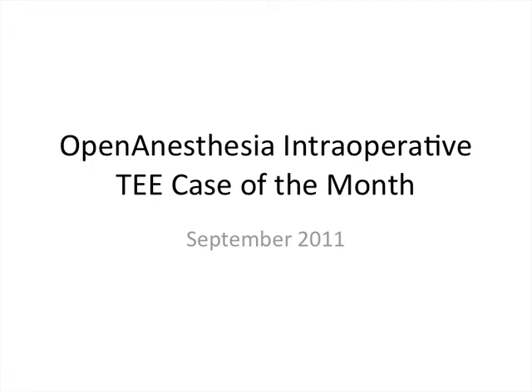This is Dr. Julie Huffmeyer with our Open Anesthesia intraoperative TEE case of the month for September 2011. Each month we feature an operative case which teaches or emphasizes an important aspect of basic intraoperative TEE imaging.